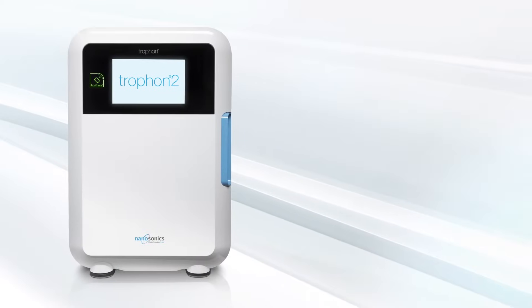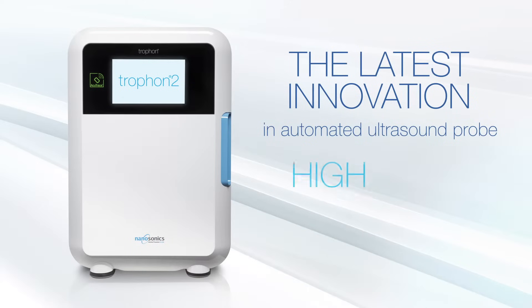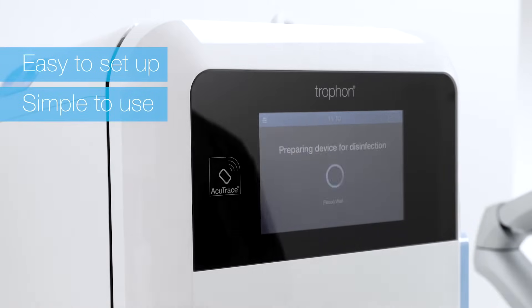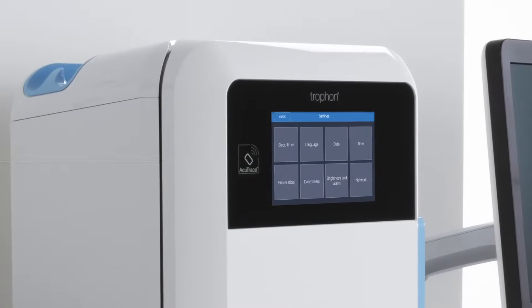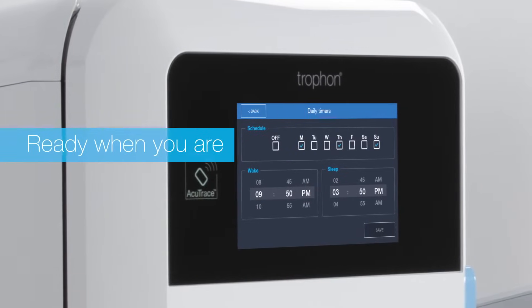Introducing trophon2, the latest innovation in automated ultrasound probe high-level disinfection. Easy to set up, simple to use, delivering fast and efficient workflows so you have more time to focus on your patients, with programmable options so trophon2 is always ready when you are.